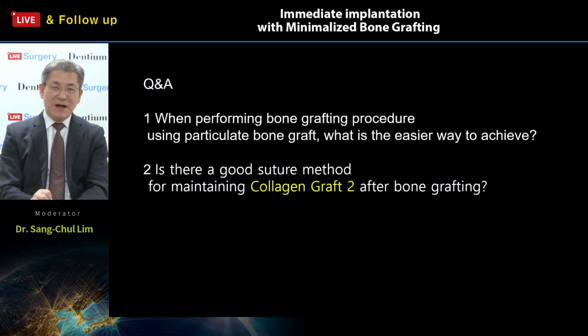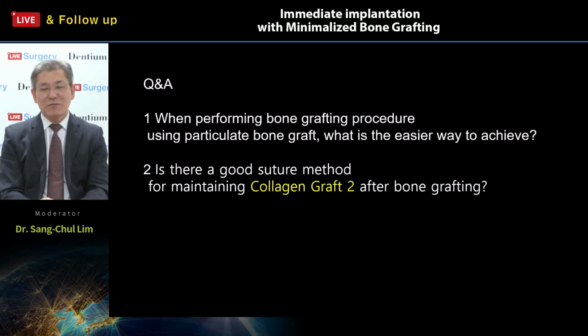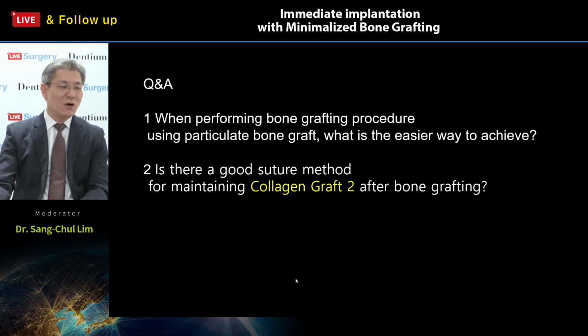All of these factors gave us a good benefit. So if it is a complicated case, I think all cases are made easier, better, and simpler using this bright tissue level. That is our today's surgery point, actually. That is my comment and point.